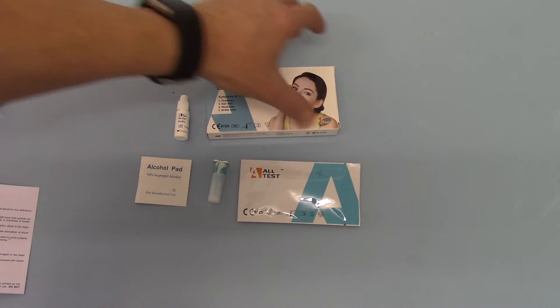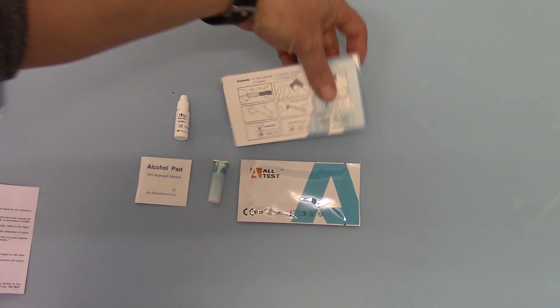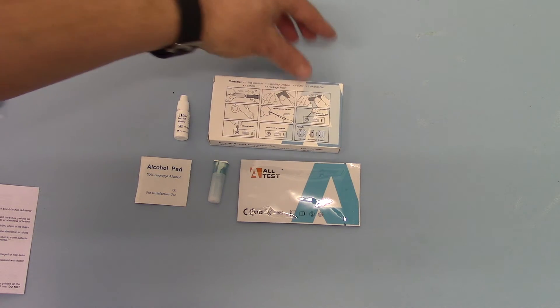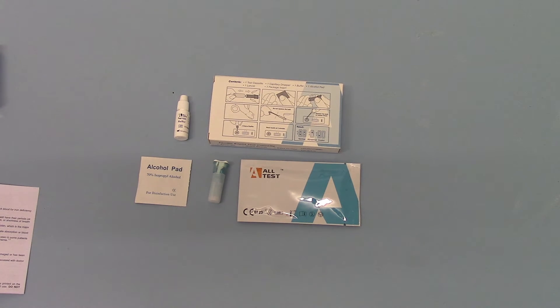Now it's a straightforward positive or negative result for ferritin. If we just show you the back of the pack there are simple instructions on there and how to interpret your results. These will give you an indication of whether your ferritin is below a certain level.